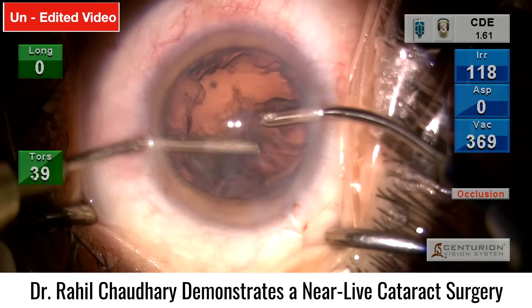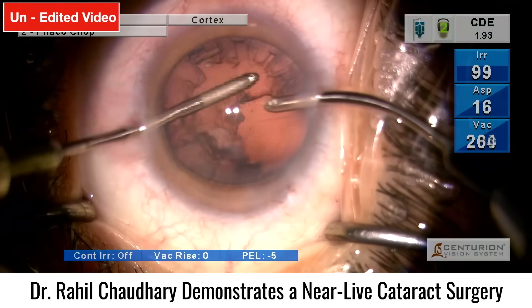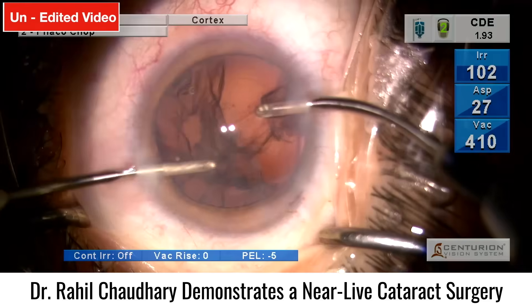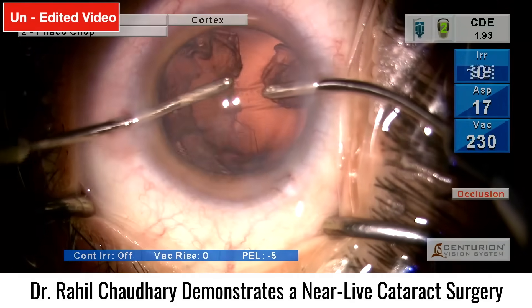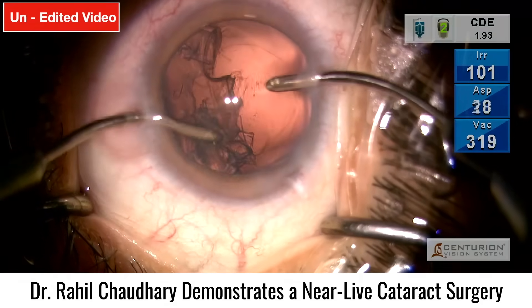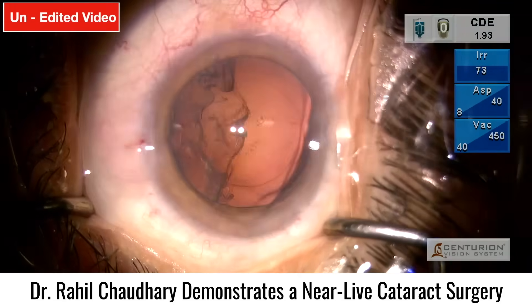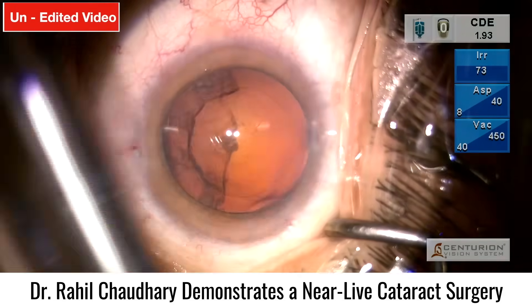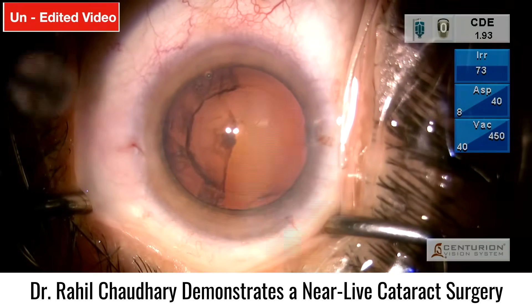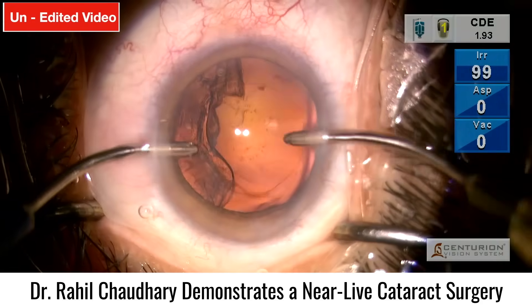Now taking off the cortex using the bimanual technique, removing the cortex from one side, then changing hands and moving on to removing the cortex from the other half.